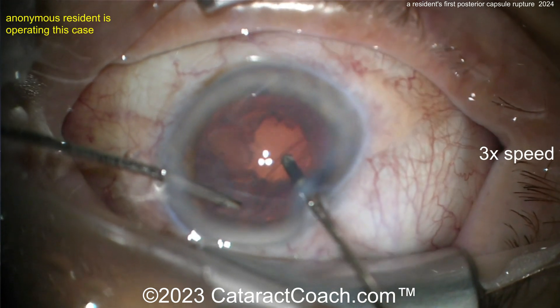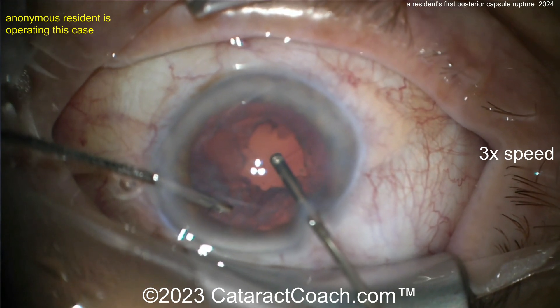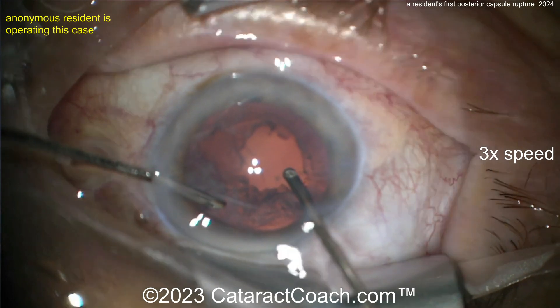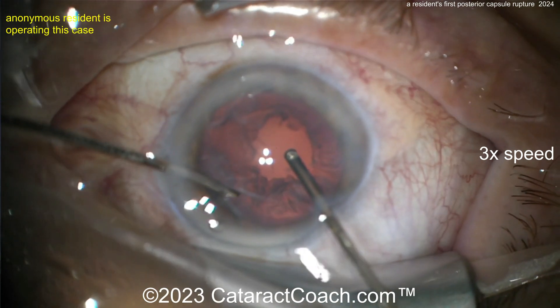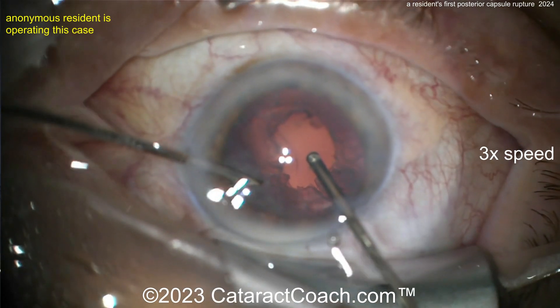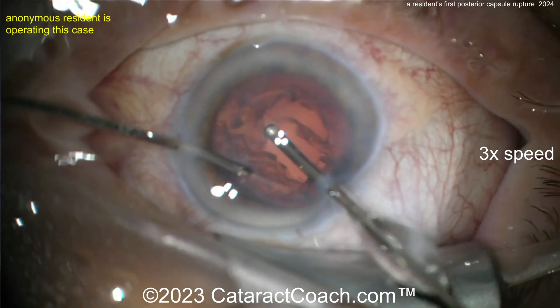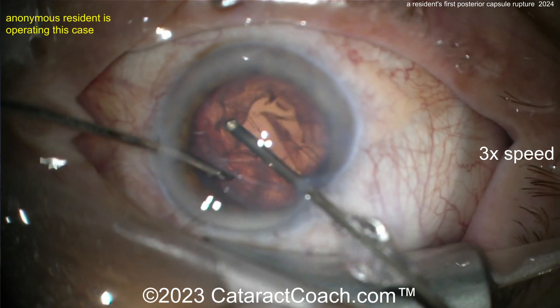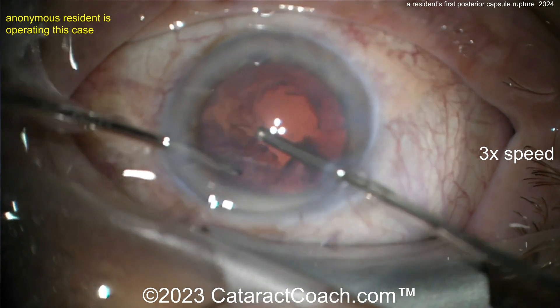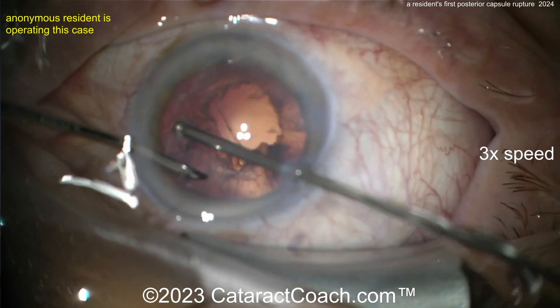Once you've cleared a sufficient amount of vitreous, switch the phaco machine settings from anterior vitrectomy to IA-cut mode: irrigation on position one, aspiration on position two, vitrectomy cutter on position three. You can use that mode or switch to IA mode to remove the lens cortex. Do not leave cortex in the eye — do not plan to YAG it later, that will be a hot mess.